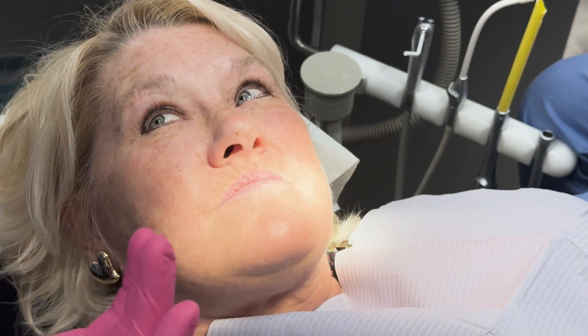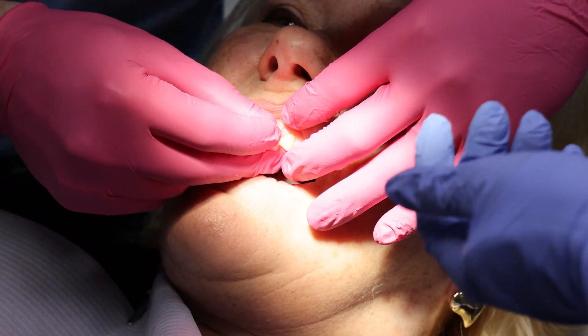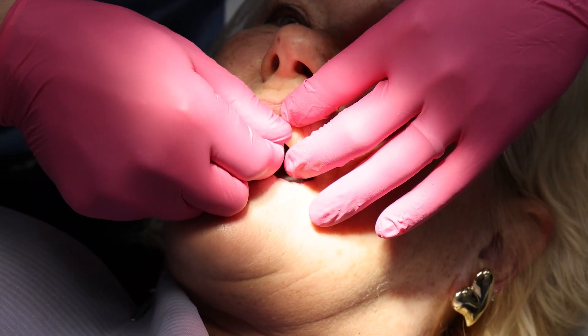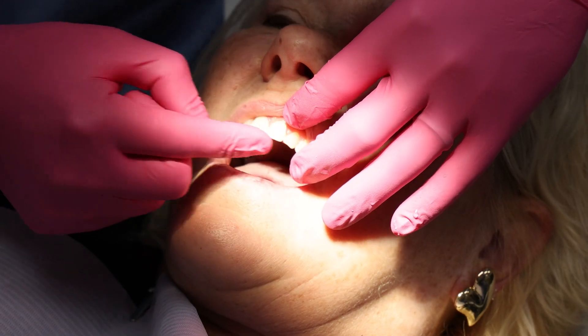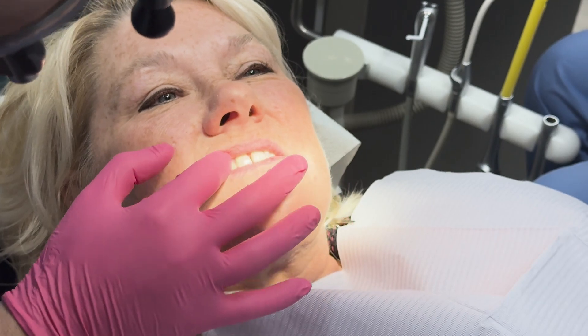What do you think? I like them, but obviously these teeth are yours. I want you to give us the final say, yes or no, if you would like me to cement these. And bite together again - you still feel like you're hitting that left tooth? A little more than the right? Okay, I can check this. Bite together and hold it, and open.